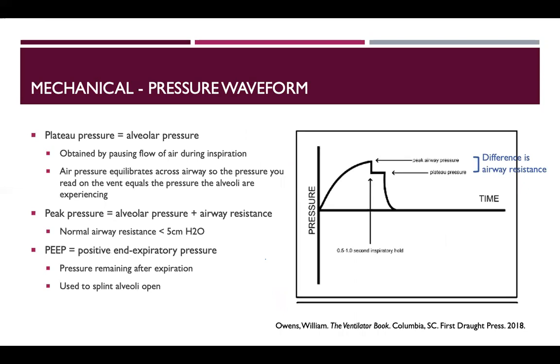Okay. So this slide is exactly the same slide from the first session. I just wanted to put it here because it's complicated and also very important for this session. Again, this is just the pressure waveform, which is usually at the top of your ventilator screen. As the ventilator forces air into your respiratory system, your pressure is going to go up until you hit the peak pressure and then come down with expiration.